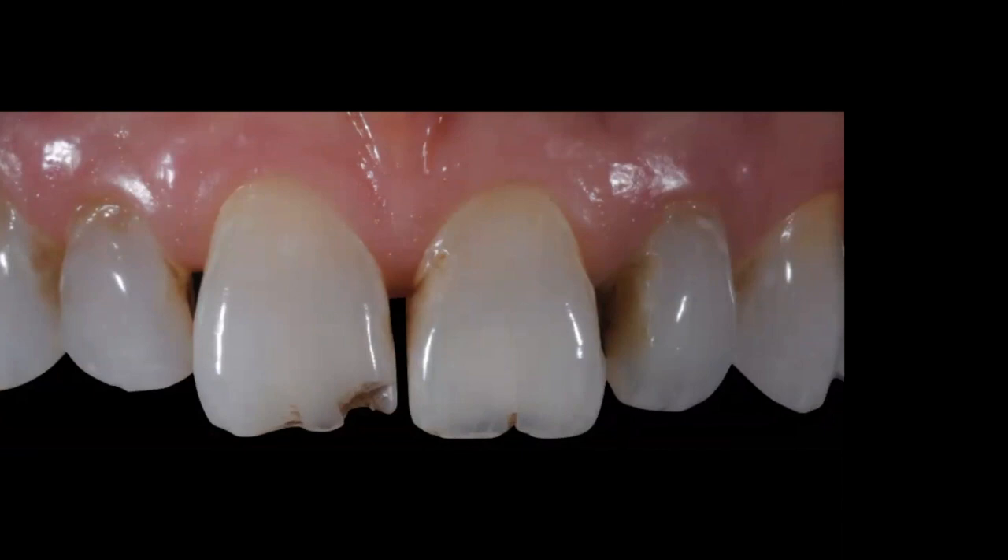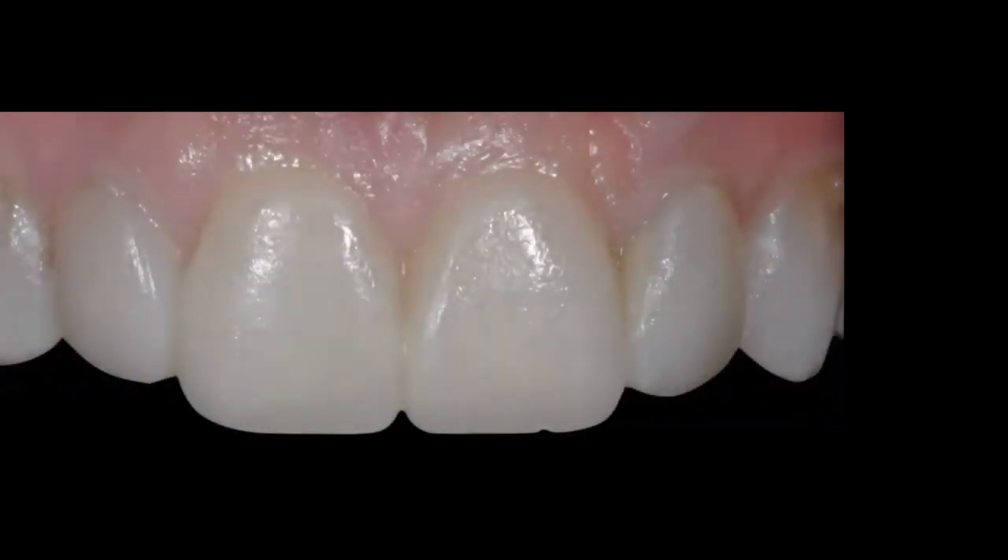One nice thing about the prototype: I don't have to do any tooth preparation. Looking at teeth 6 and 11 — the canines — you can see the laterals and centrals are slightly more lingual relative to the canines, confirming this is an additive case requiring minimal reduction. I only need to remove stains and any unsupported enamel, then spot-etch, prime, bond, and deliver the prototype.